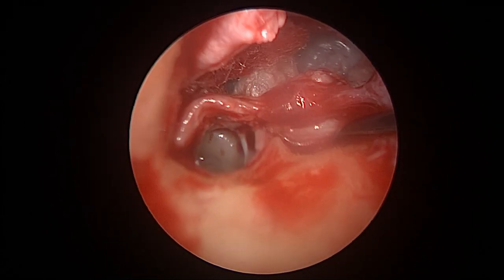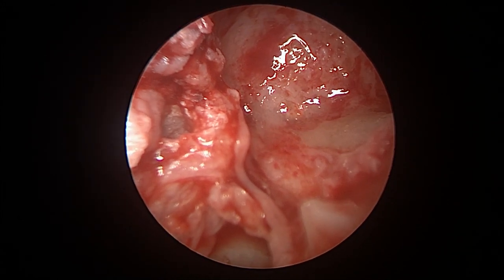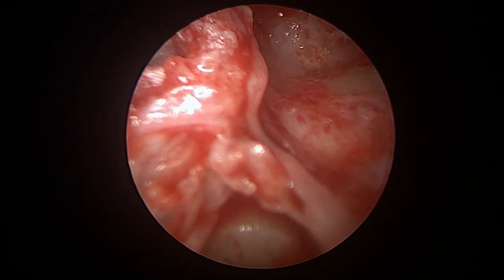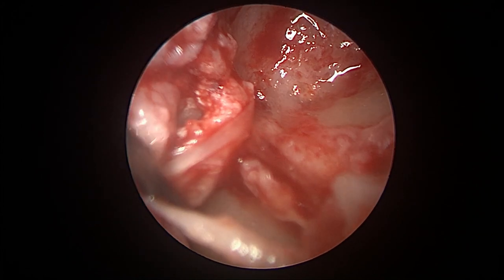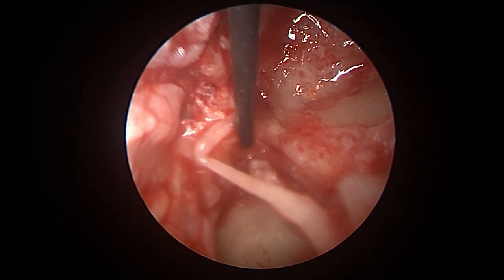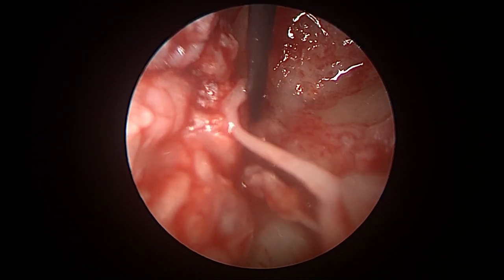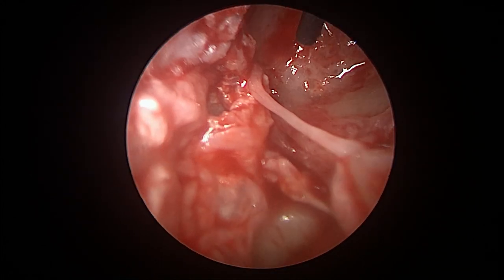After cleaning the Attica cholesteatoma through the transcanal and the combined approach, we find that the facial nerve has been exposed. As you can see now, this is the chorda tympani, and we are using the nerve stimulation probe for that section as well as stimulation of the nerve. The nerve is completely exposed with no bone cover at all.